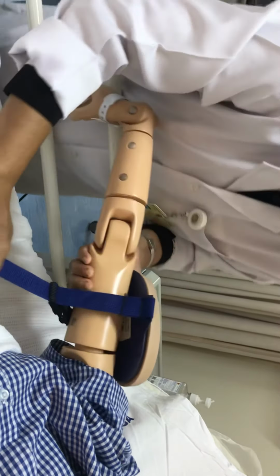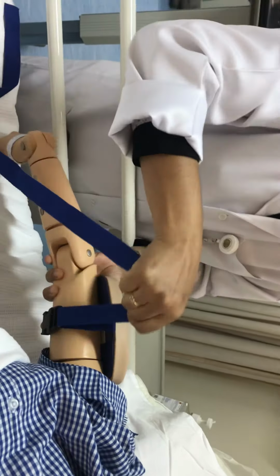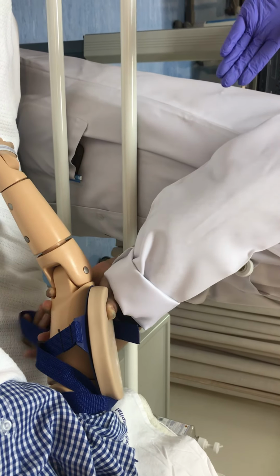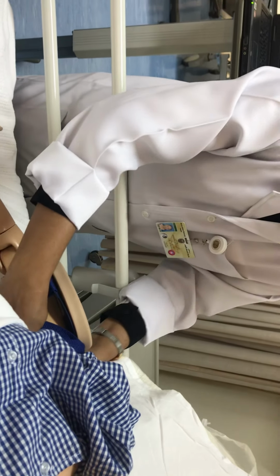Like in the exam, one of the processes is for them to ask the patient. The teacher will not prepare the area. They have to prepare, after asking. But the teacher is answering. For example, when the student asks where the last injection was given, they gave it in the abdomen. I want it in my right hand.